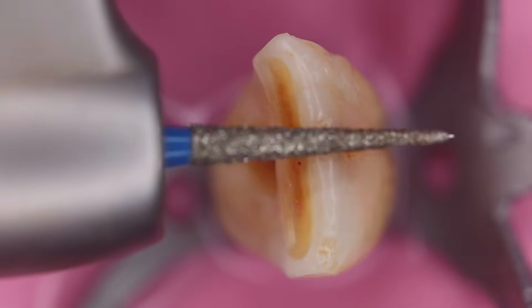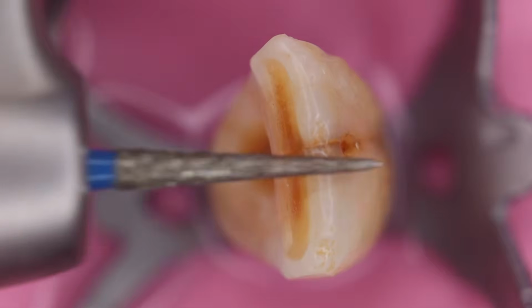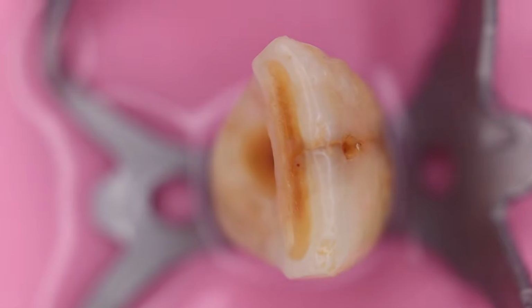Now we are using the tapered fissure bur to define the access cavity shape basically, and not going into the pulp chamber.